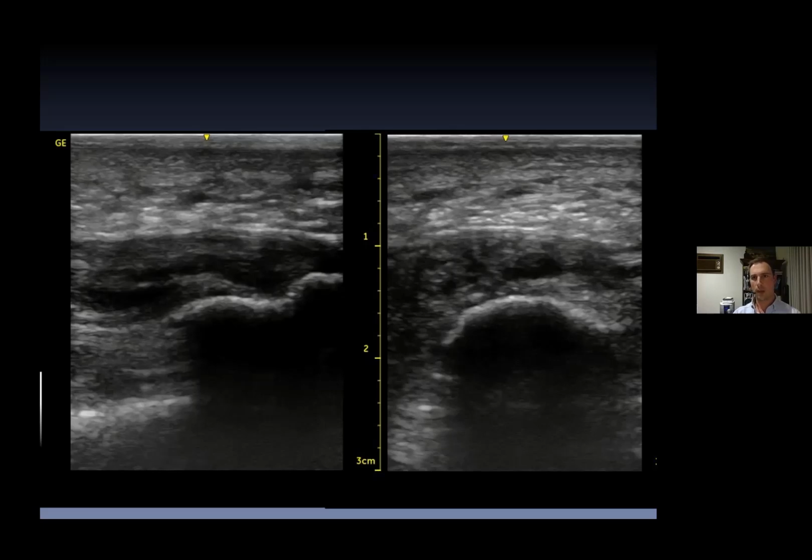Yes. Yep. And that's what I do explain to patients, is it can take time. Particularly the insertional stuff. When you're dealing with an Achilles insertional pathology, I will tell those patients they're not necessarily going to get the same response that the mid portion will get. Mid portion I love treating because the success is probably 98%. It works very, very well if it's timed right.